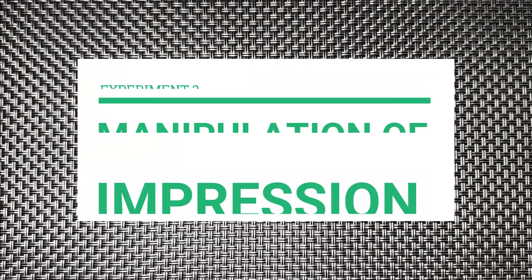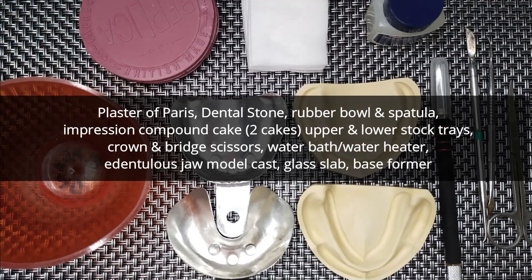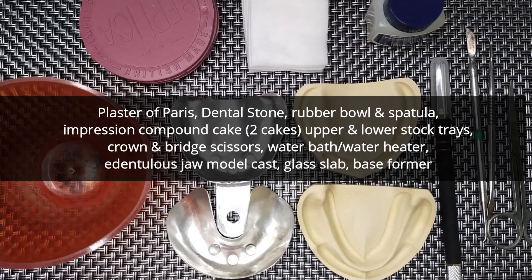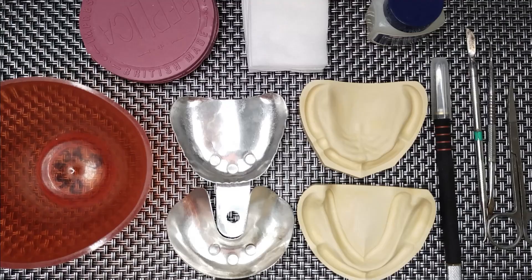Making an impression using Impression Compound. First, prepare all the materials needed for the procedure. These are your rubber bowls, your Impression Compound cakes, your 8x8 gauze, your Vaseline, your carvers, your scissors, your models, and your aluminum stock trays.